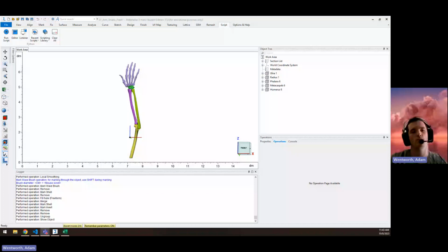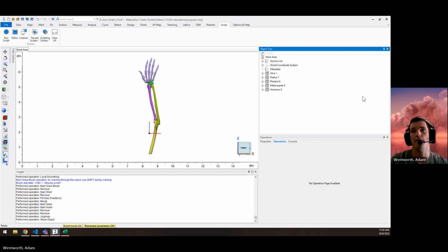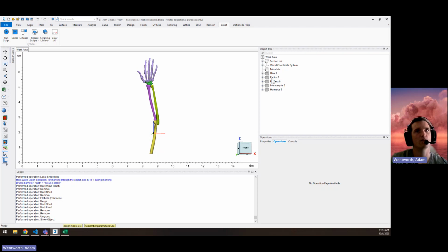Use some pretty basic but useful scripting operations for 3-matic for anatomic modeling. So here we've got a file of a right upper extremity that might look like how you get it out of segmentation. So parts could be a little bit rough.